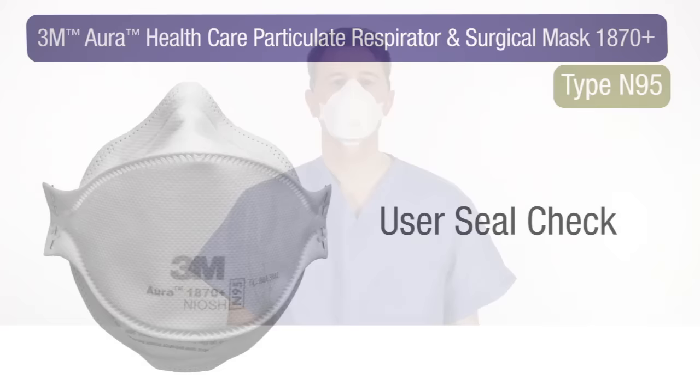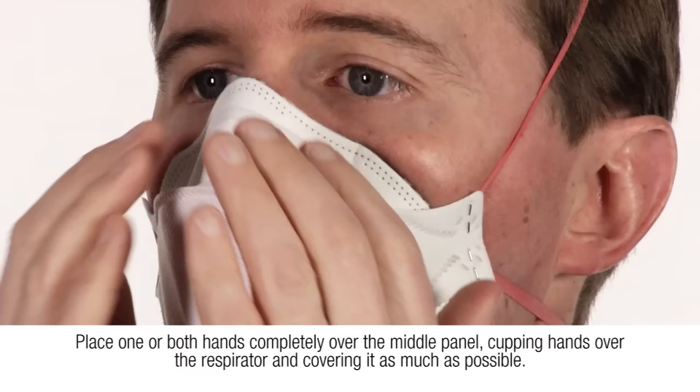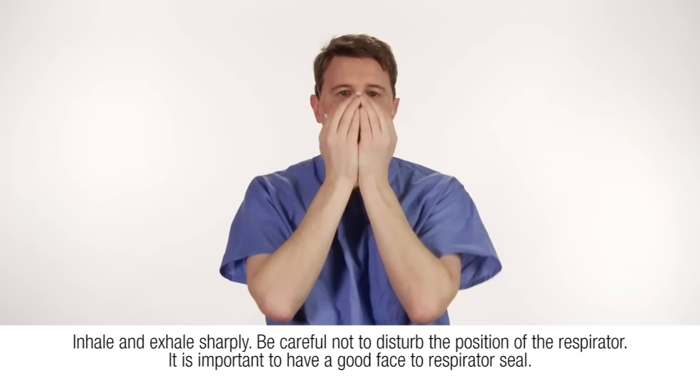Perform a user seal check each time you've donned a respirator. To conduct a user seal check, place one or both hands completely over the middle panel, cupping hands over the respirator and covering it as much as possible.